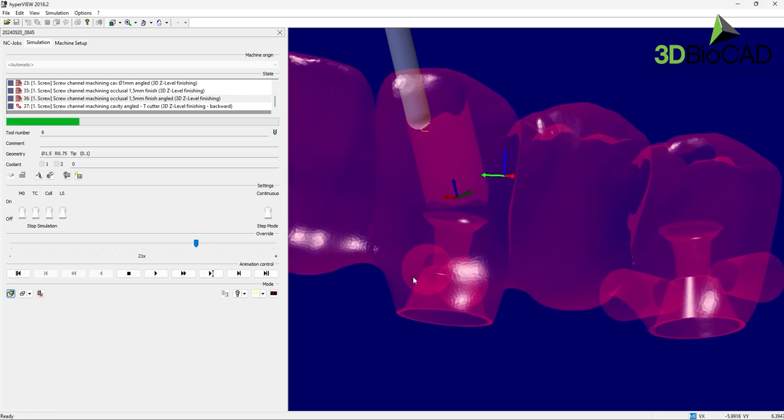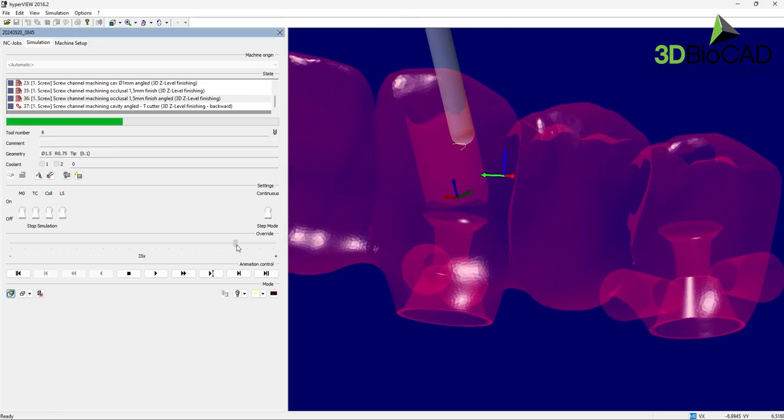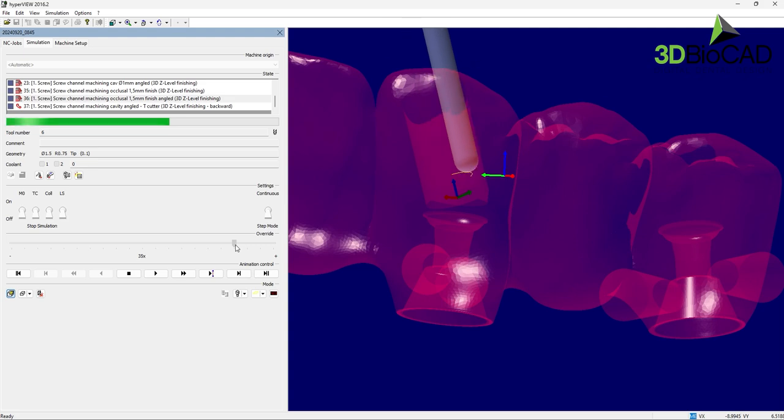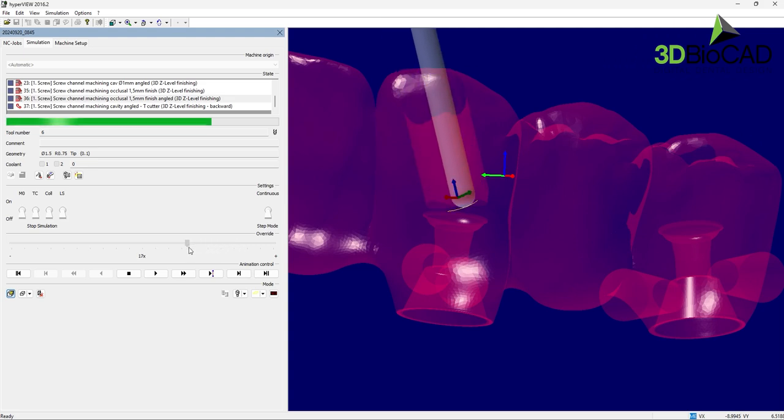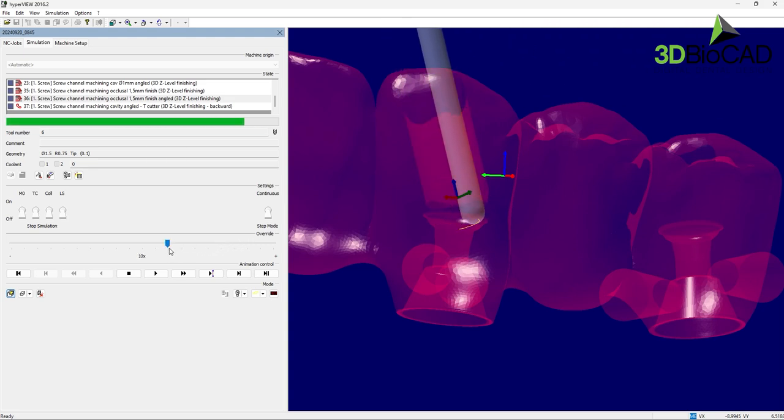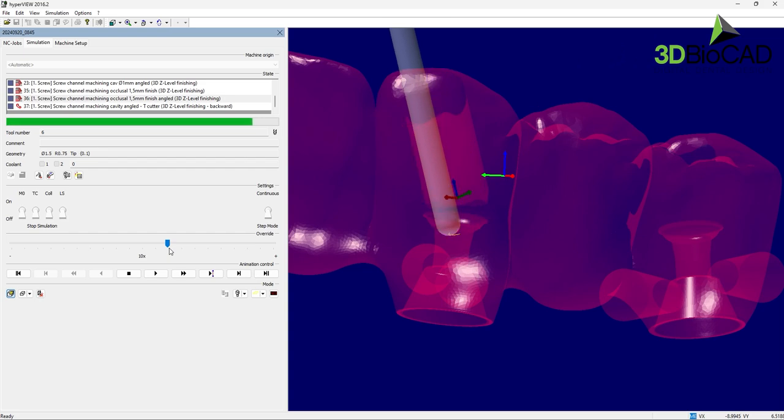The ball-shaped burr will reach through the screw seat area from the occlusal side. Then the specialty cutter will enter from the cavity side to mill the taper that was missed from the occlusal side.